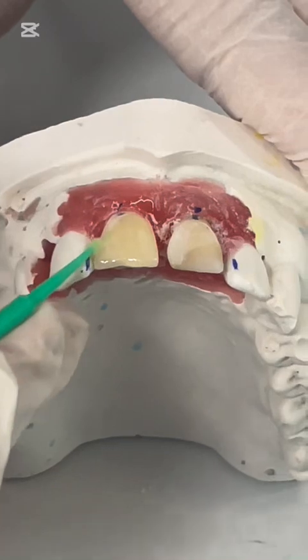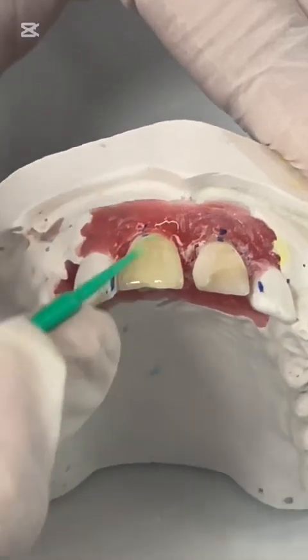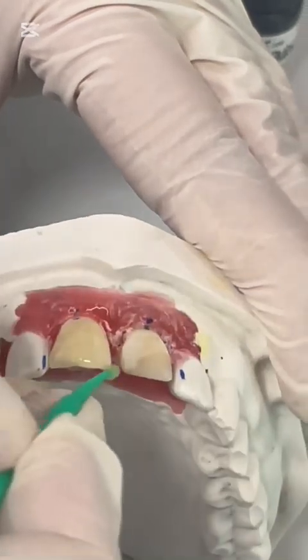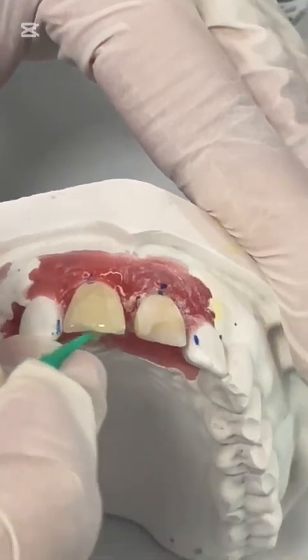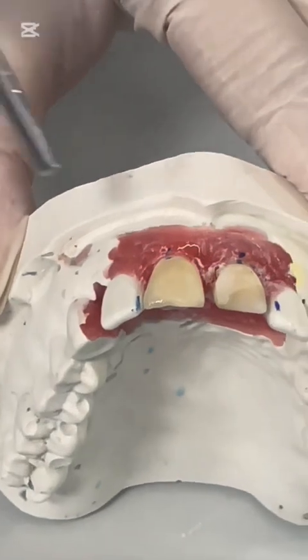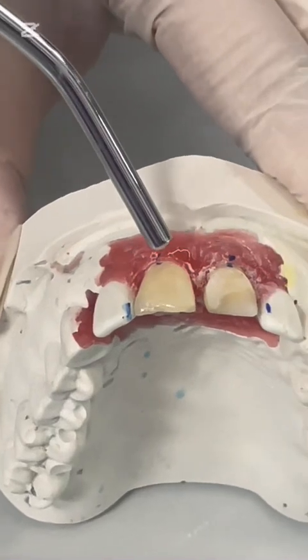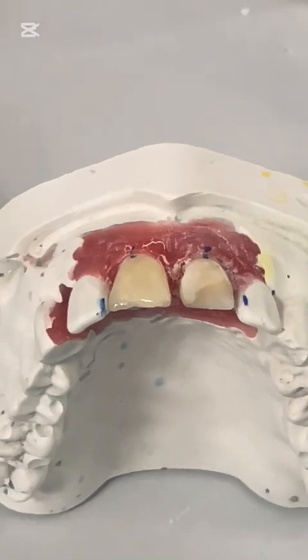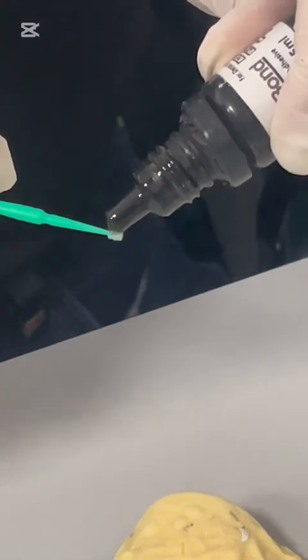Can you see the difference in the color of the tooth surface now after etching? It's yellowish, and now after the bond it starts to be smooth and shiny. Drying until nothing is moving. Then the second layer. Again, doctor, why a second layer?